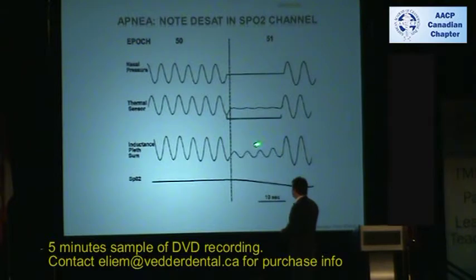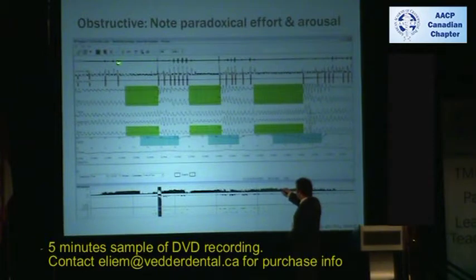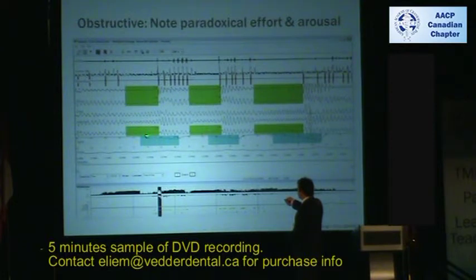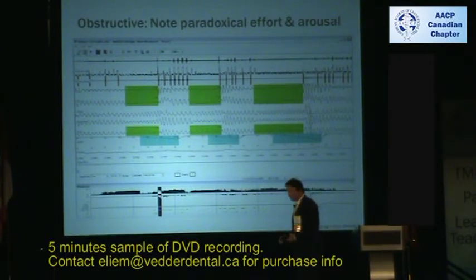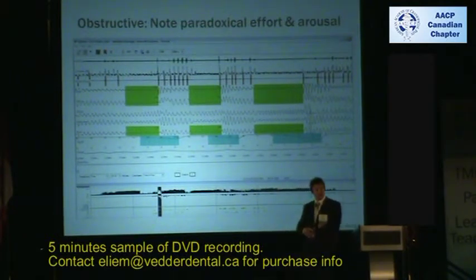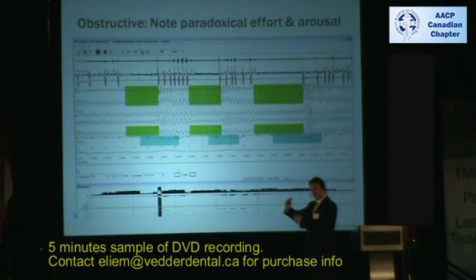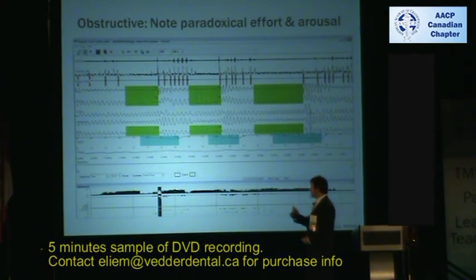With obstructive apnea, you've got continued ventilatory effort but no air flow, followed by desaturation. Looking at snoring audio, nothing is going on here, then you have a flat line with continued ventilatory effort. The sum channel confirms a paradoxical effort. During an obstructive event, if you put your hand at the intake of a vacuum cleaner, you hear the motor starting to strain — the exact same thing happens in the human body. If you close your mouth, plug your nose, and try to breathe, your chest and abdomen will become desynchronized — and that's what we're seeing.